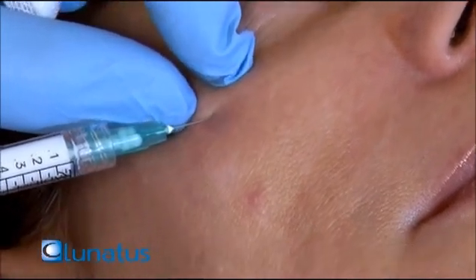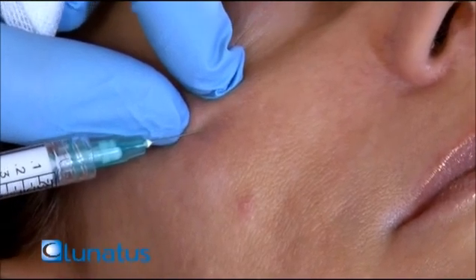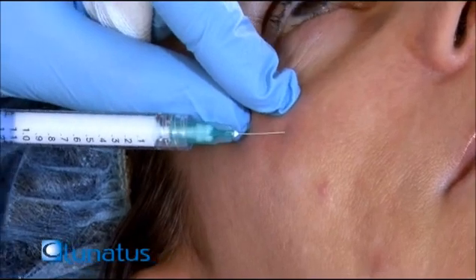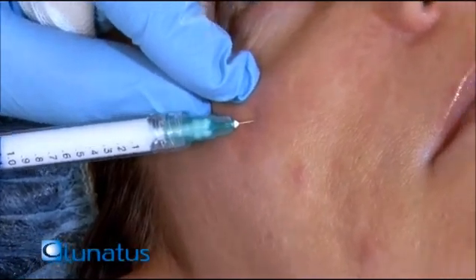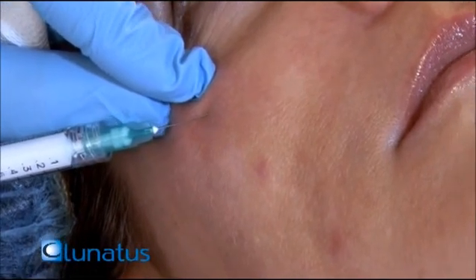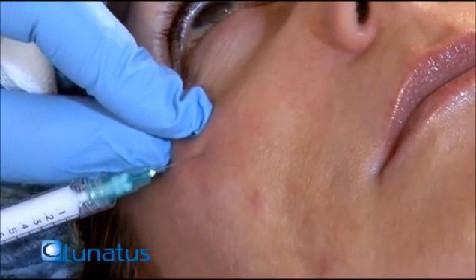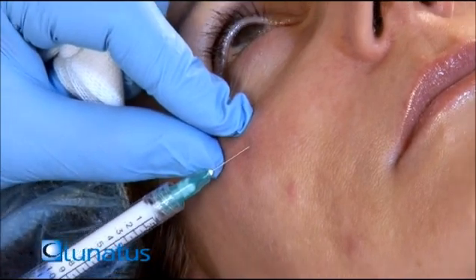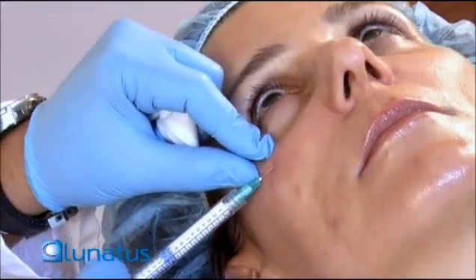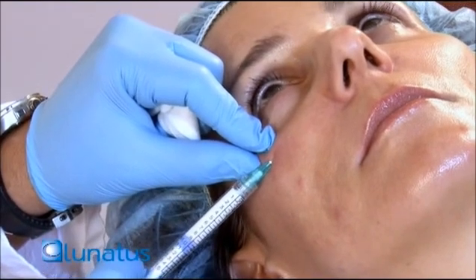So we're putting a little bit of the material. I usually like to fan things. So with the same insertion point, I tend to turn, and I do the same thing, anterograde and retrograde. Always, always, my non-dominant hand, as you can see, is touching the globe. I'm protecting the eye, and at the same time I'm not allowing the filler material to seep into the globe itself.